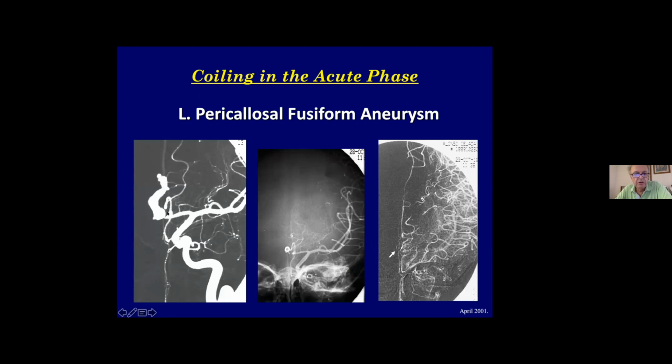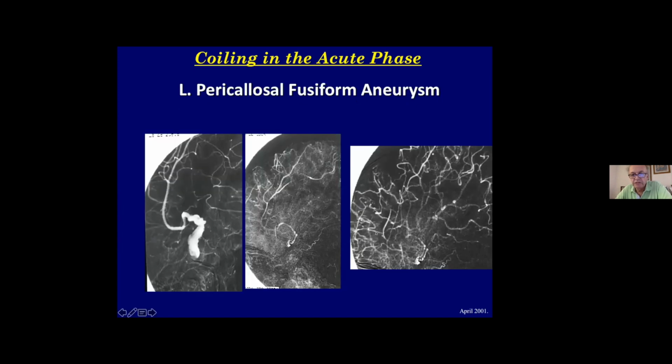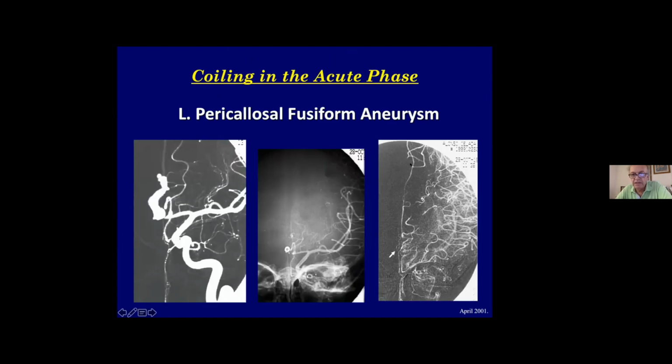This is before, this is after, and in the late phase, you see the collateral anastomosis.